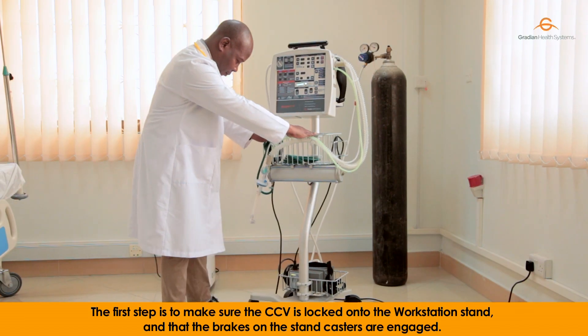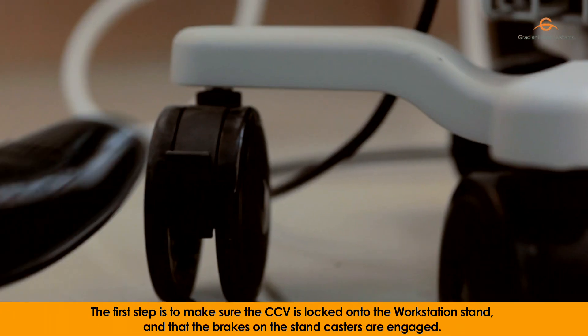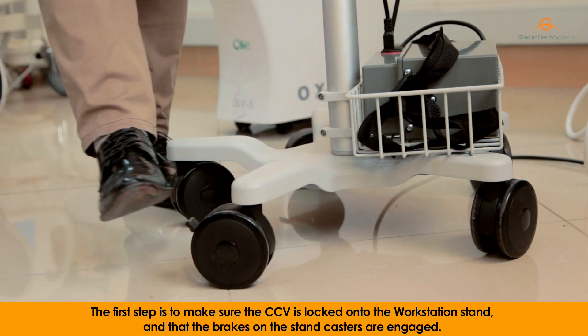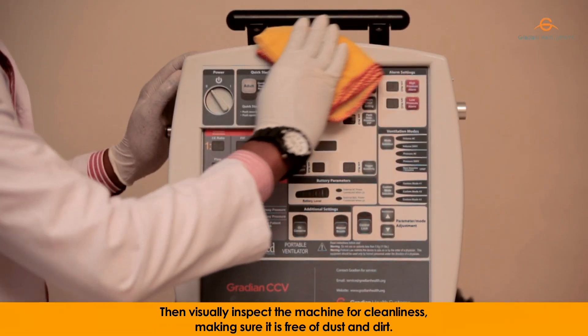The first step is to make sure the CCV is locked onto the workstation stand and that the brakes on the stand casters are engaged. Then visually inspect the machine for cleanliness, making sure it is free from dust and dirt.